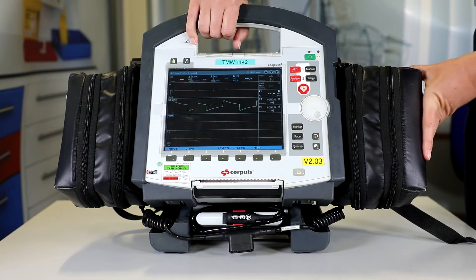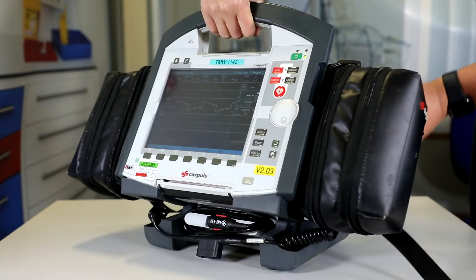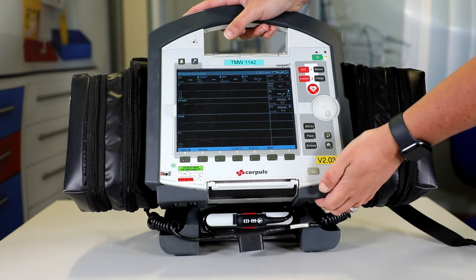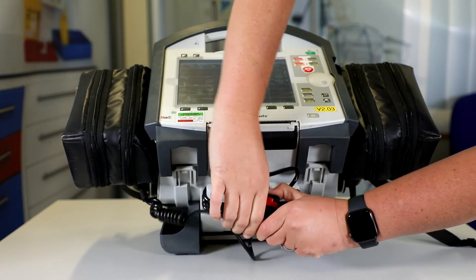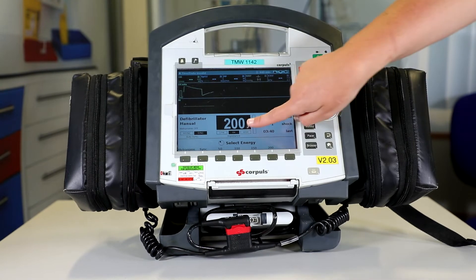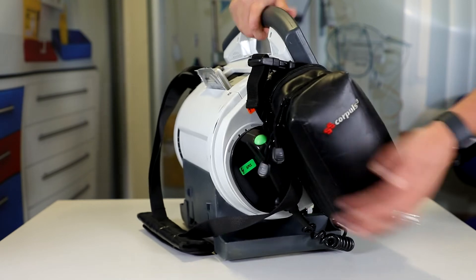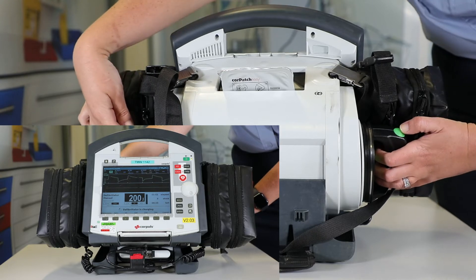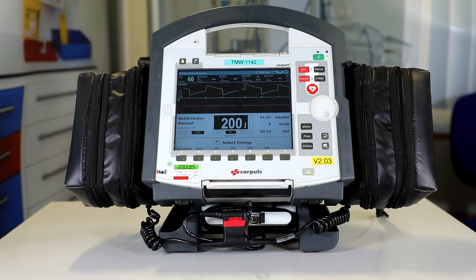For check 3, the first thing we need to do is check the seated paddle position — we turn it around like so and check they're nicely seated. We then attach the therapy master cable to the paddle cable; this is a bit easier if you tilt the Corporal. We pull it out like so, attach it in, and you should hear a nice click. Then select the manual button, check that we're at 200 joules, and press one paddle button to load the energy up to 200 joules, then press both buttons at the same time to deliver the shock. Then press the monitor button to come out of that screen.